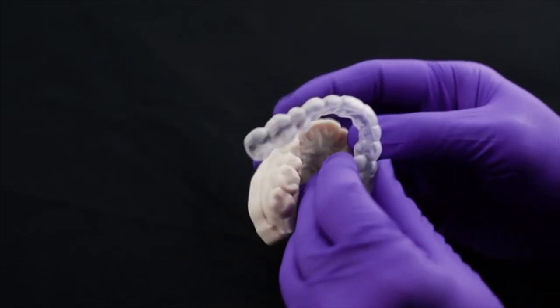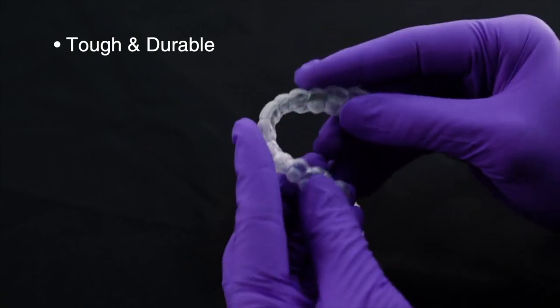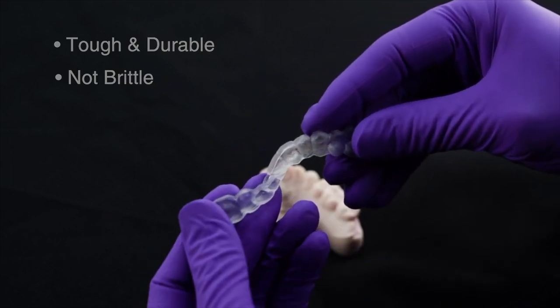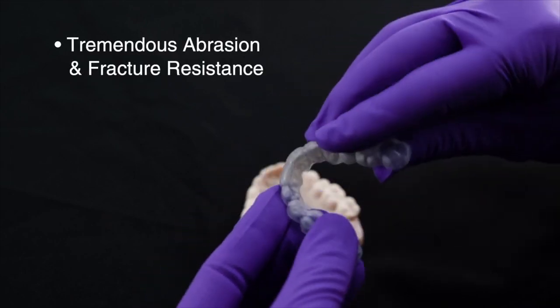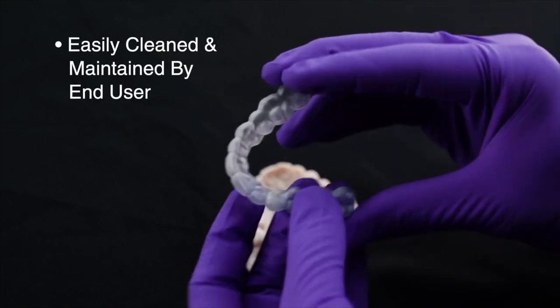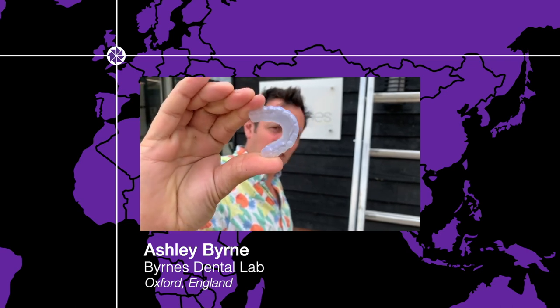Like a hard splint, KeySplintSoft is tough and durable and able to withstand the forces of bruxism. Unlike a hard splint, KeySplintSoft is not brittle and remains flexible for patient comfort with tremendous abrasion and fracture resistance. It is also easily cleaned and maintained by the end user — you can't do that with any splint material on the market.